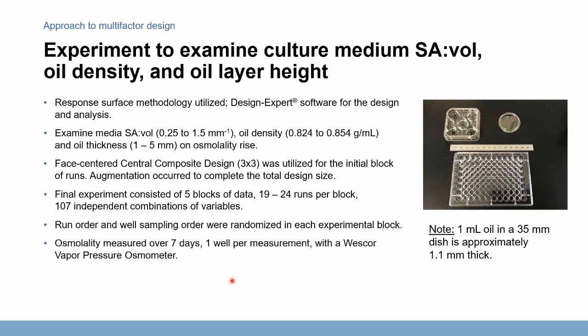That's really difficult. But at least to get some, generally speaking, if the cohort of embryos shows stress, then the developmental rate will be reduced. And that at least gives you an initial point to start with. We would expect that if the conditions are better, the embryo development rate would be better. And so at least we can start there.